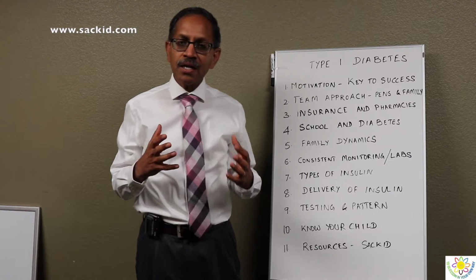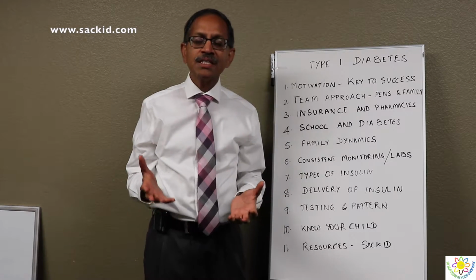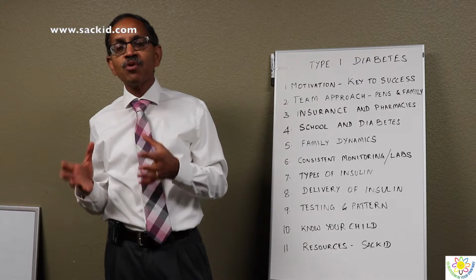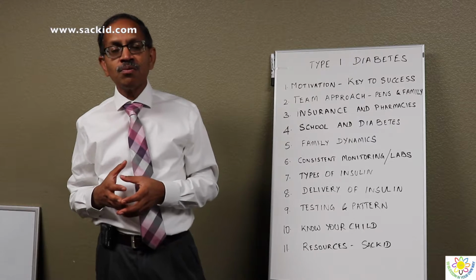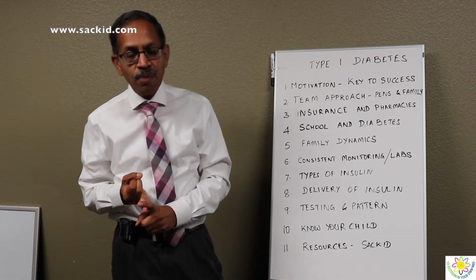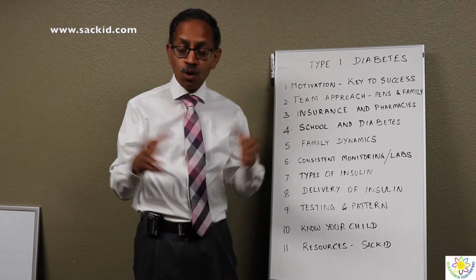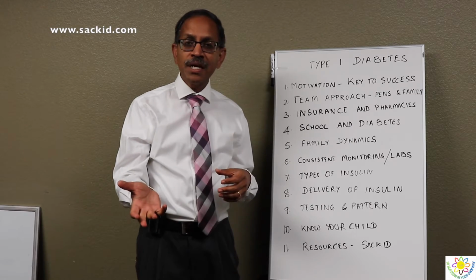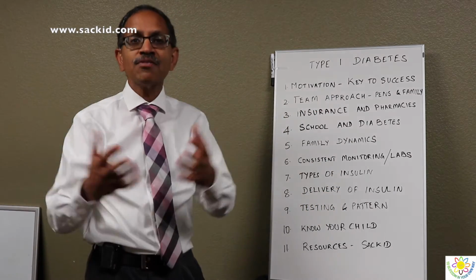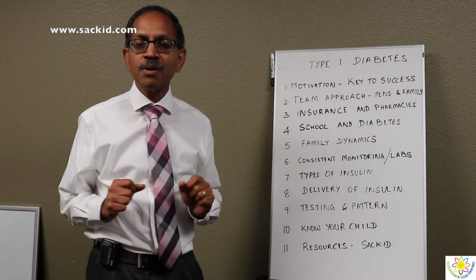How to use the pen and how to use the pump will be taught by your diabetes care team, and that's an important place where the team will provide you with the right kind of input to choose the right kind of pen for your child and the right kind of pump for your child. And your healthcare provider, the pediatric endocrinologist, will coordinate, write the letter of medical necessity, talk to the insurance company, and talk to the pharmacies to coordinate delivery of the latest ones. Again, we need to work as a team in order to give the best care for your child.